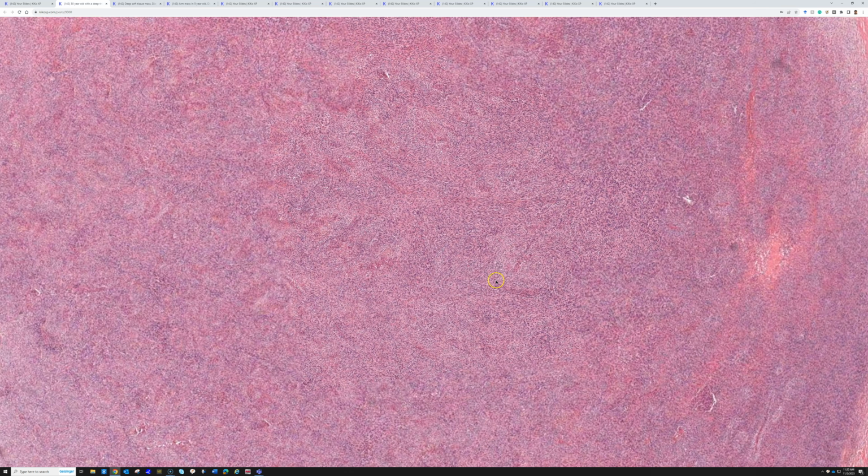And also there's a lot of variability in the pattern and cellularity, which is something that I find true of low-grade fibromyxoid sarcoma as well, that you have variable cellularity and variable background of myxoid to sclerotic throughout the tumor. So there's heterogeneity. Here's another example from a different patient. This is also sclerosing epithelioid fibrosarcoma. Again, that heterogeneity, cellular and then less cellular, sclerotic collagen background, and then other areas with a bit of myxoid background. And that can be a useful clue to the diagnosis.